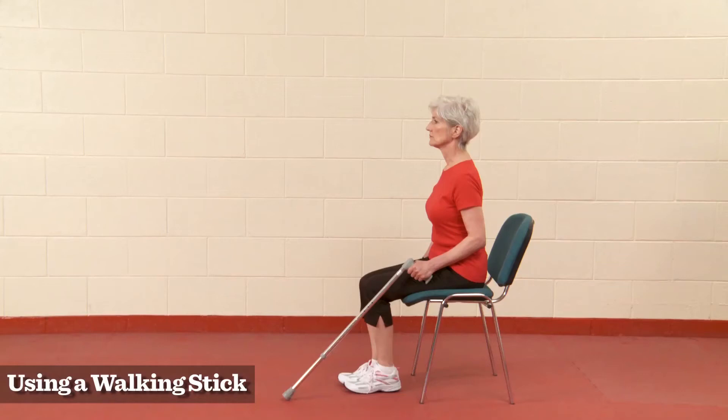A walking stick should always be held in the hand on the opposite side of your bad leg.